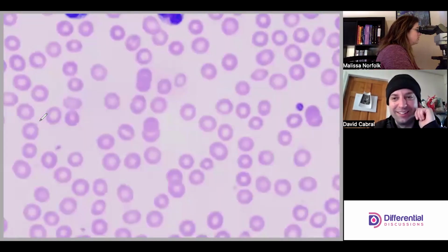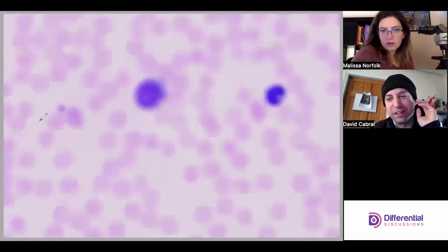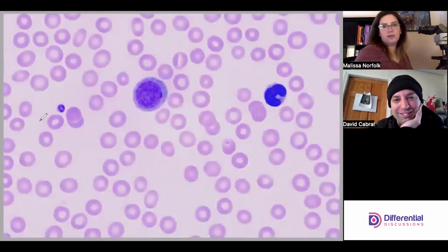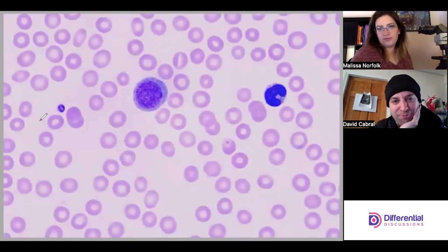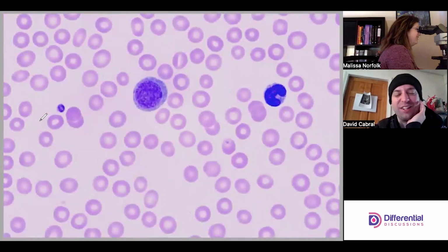There's another one over here. Let's see what this is. More reasonable looking. More reasonable looking pro lymph. Yes, the other one was much scarier.